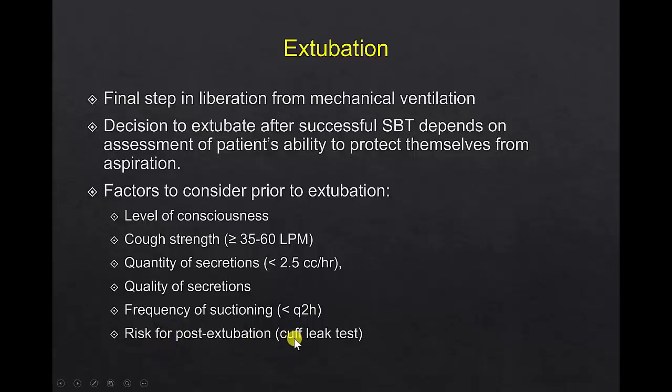The problem with a cuff leak test is that although it's fairly sensitive to successful extubation, it's not very specific. We have people that fail a cuff leak test but do fine.